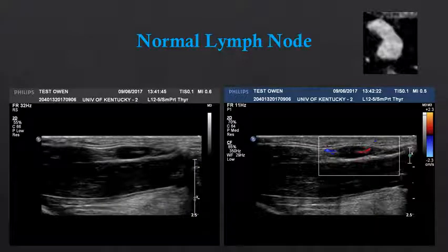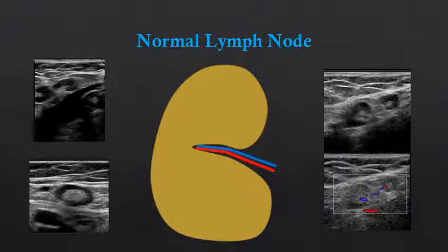Let's take a look at another characteristic lymph node. Again, you see a smooth hypoechoic cortex with a central echogenic fatty hilum, and we can see the hilar blood flow in the area of the echogenic fatty hilum. Here I have provided multiple examples of normal lymph nodes for your reference. We can see these lymph nodes that have smooth hypoechoic cortices and central echogenic fatty hilum.